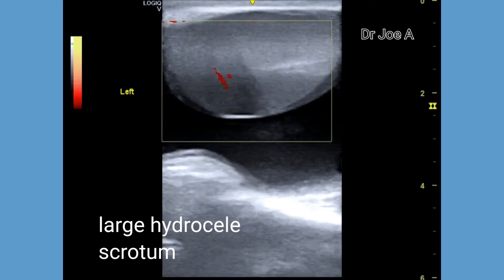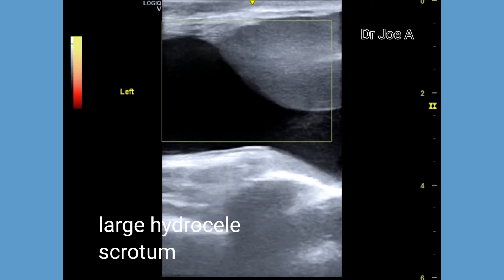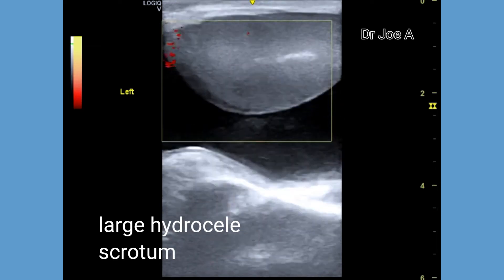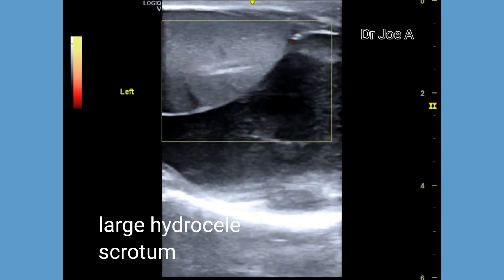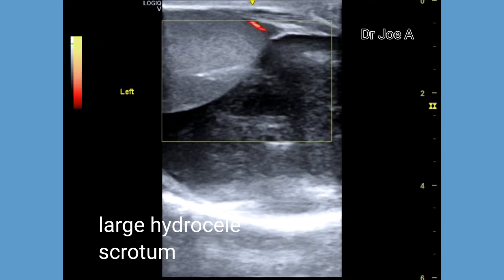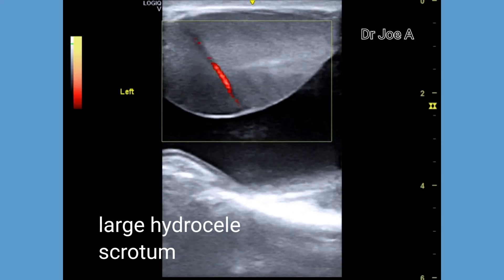A minor surgery is usually sufficient to correct this problem. Power Doppler ultrasound shows normal vascularity of the left testis, suggesting that there is no significant inflammation of the left testis.